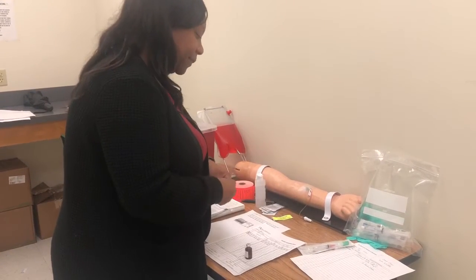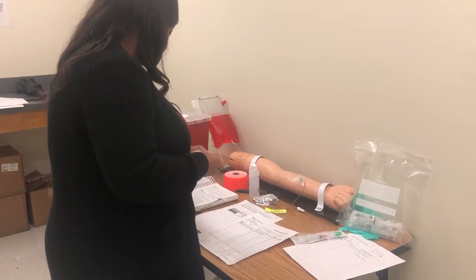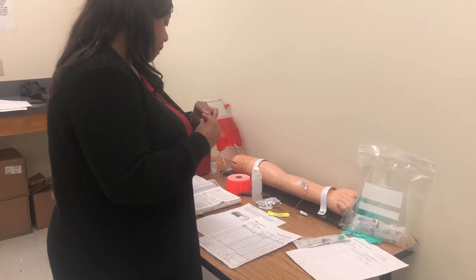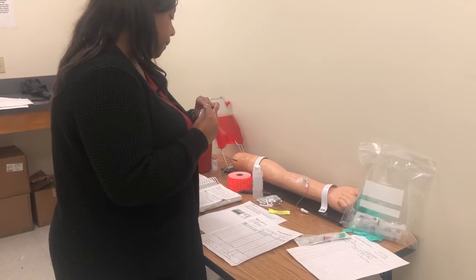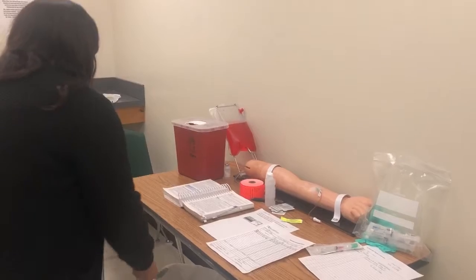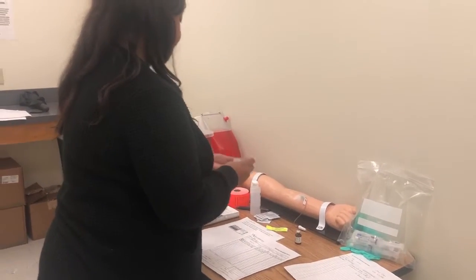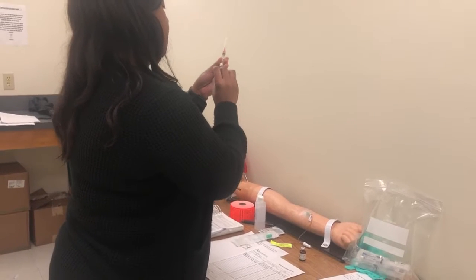Clean up. I'm going to clean for 15 seconds. And pull up my 3 milliliters.